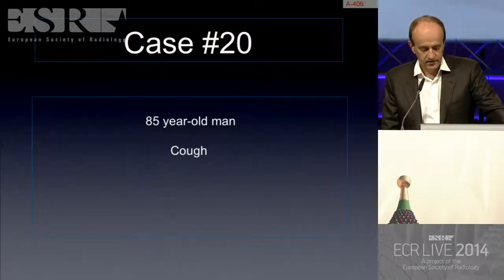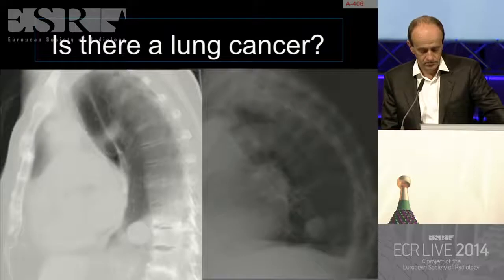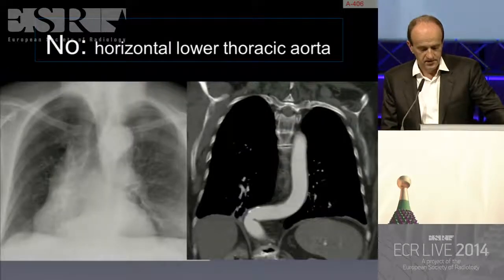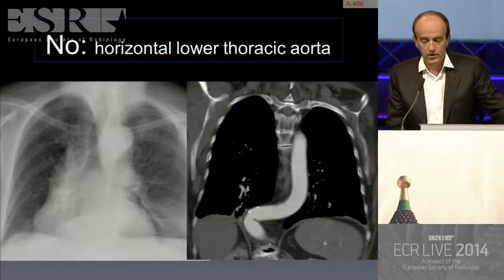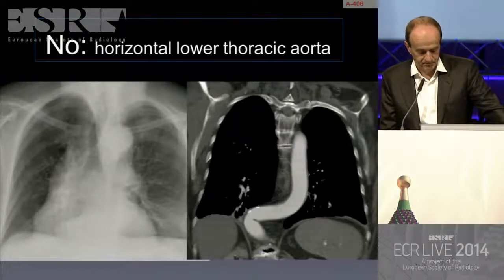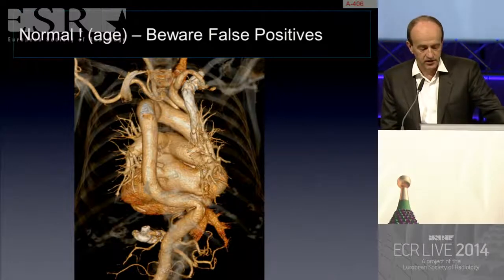Case 20: an 85-year-old man with cough. On the lateral view there is an opacity — clearly rounded and very regular — that appears to be a nodule or mass. However, this is a horizontal lower thoracic aorta mimicking a nodule. Beware false positives: in elderly patients, the aorta can be horizontal.